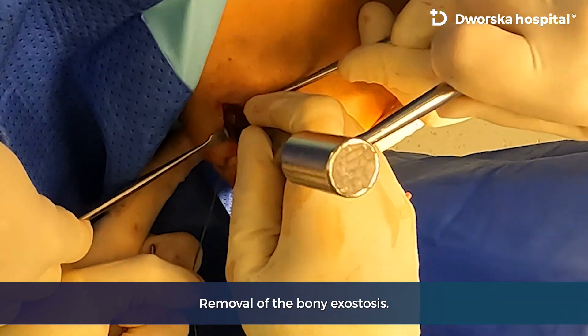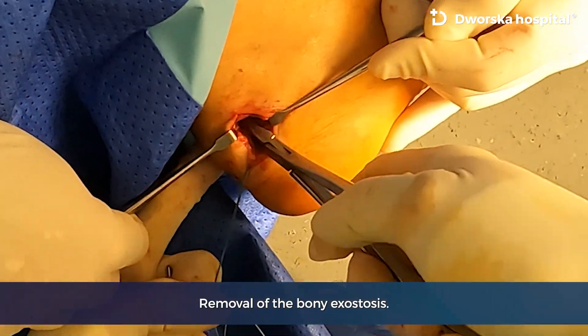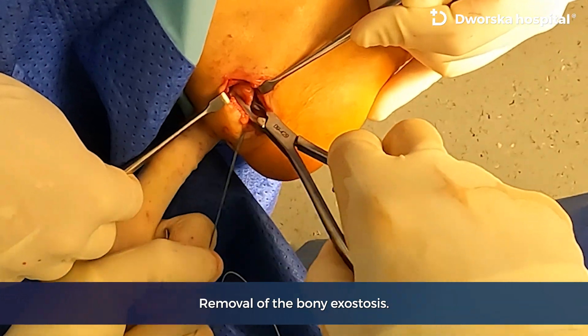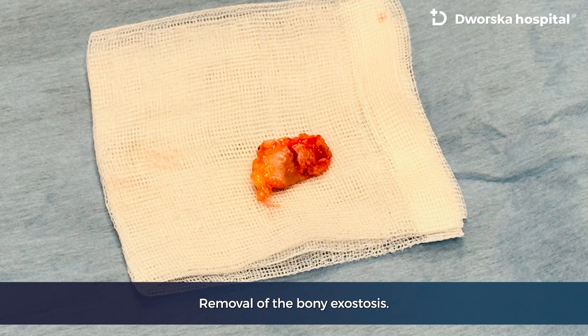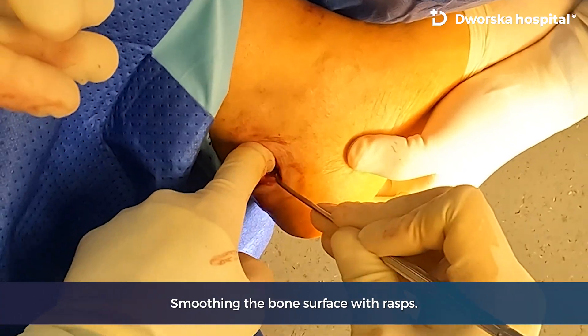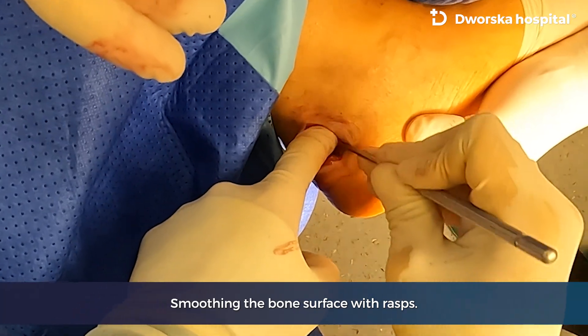Removal of the bony exostosis. Smoothing the bone surface with rasps.